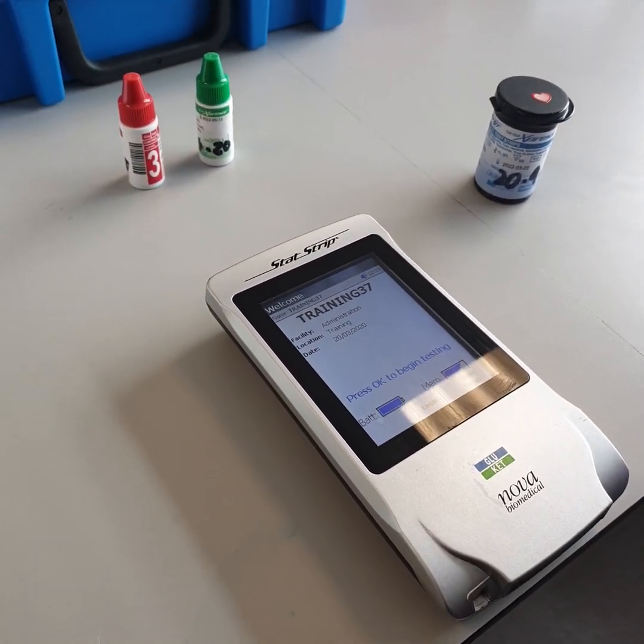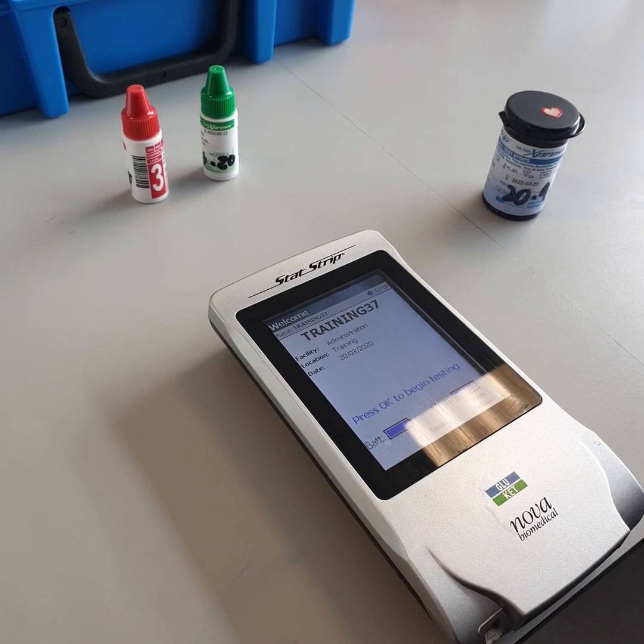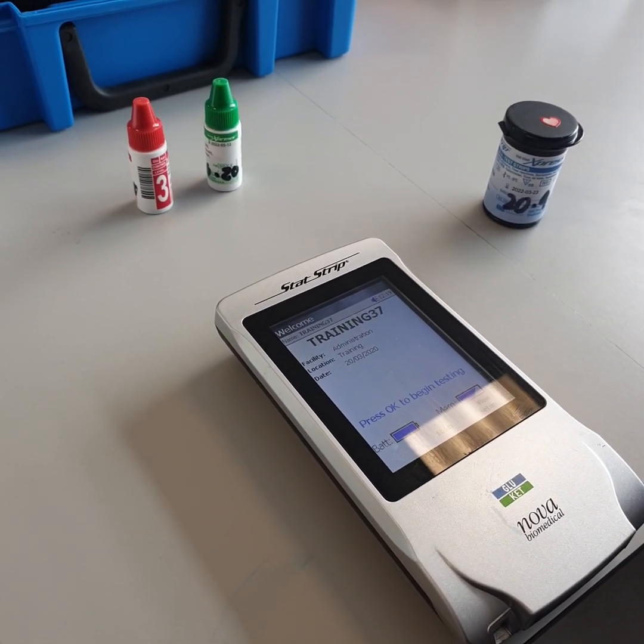Successfully processing both levels of QC unlocks the device so that it can be used for patient testing.